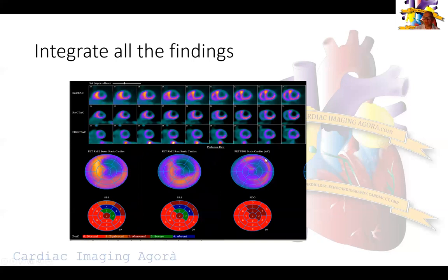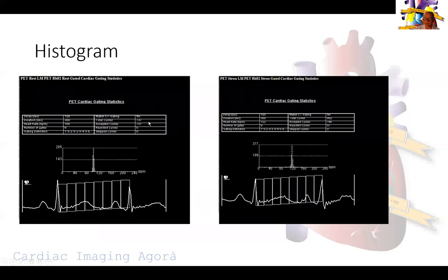We put everything together on a polar map — this is what our physicians see in the electronic medical record when they open the report. They can visualize the inferolateral defect, its extent and severity. It gives a visual impression that is easier to grasp than text alone.